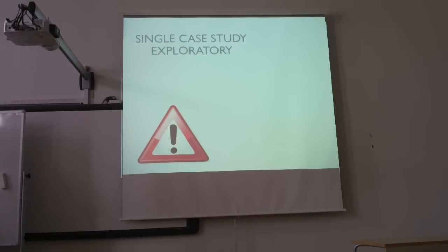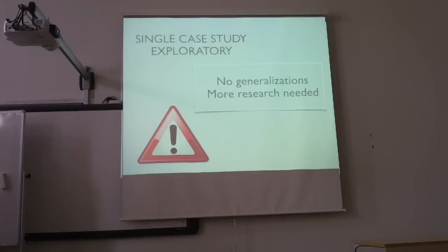So this is a single case study, it's exploratory. We cannot make generalizations yet, there's more research needed, obviously. We have lots more footage. A lot of the times we have seen the same as in this case, but a lot of the times we didn't see what we would have wanted to see. If you understand what I mean.